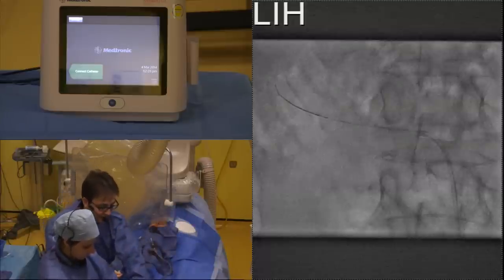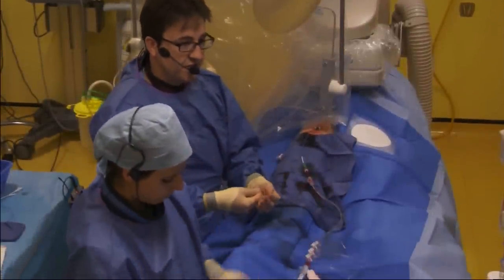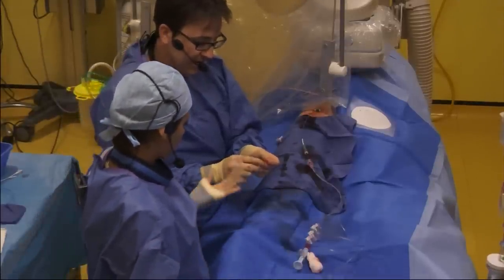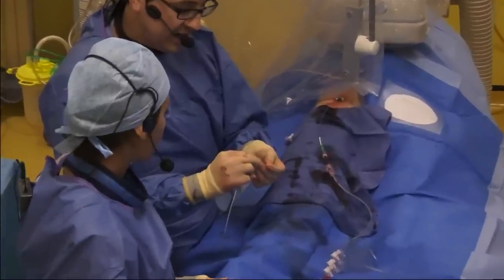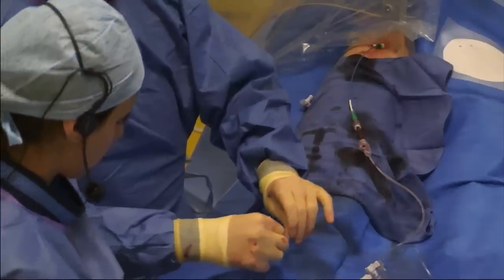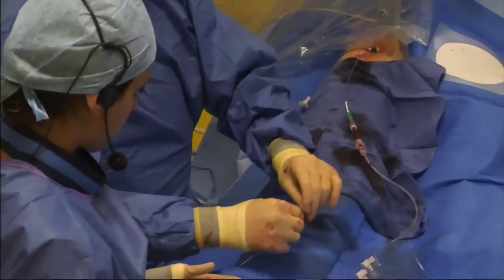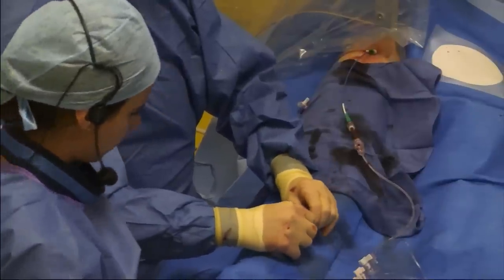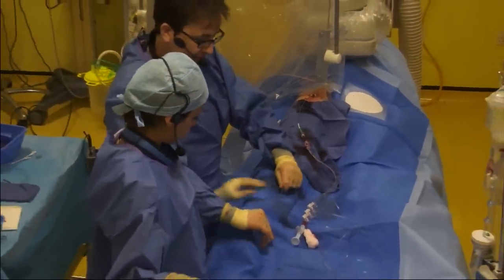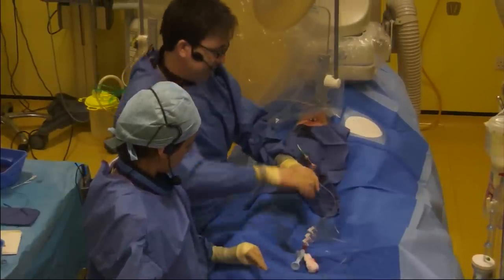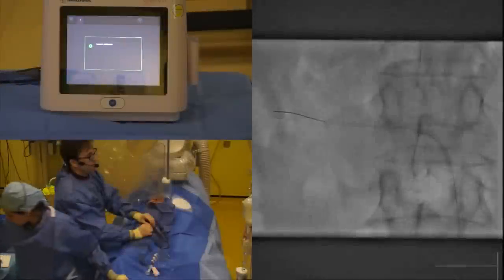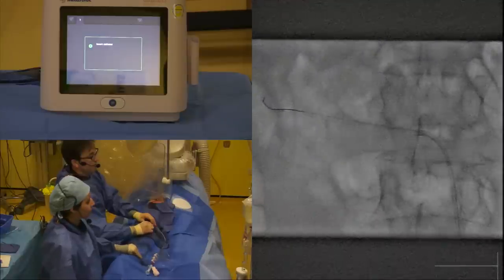We've got the spiral catheter out again. I'm just going to run through this and take you through how I would do this from a clinical perspective. Rush is connecting that up to the console itself. I'm attaching this to the guide rail. I've actually elected to go for a choice rail again, same as we ended up with in the last case, just really because I think, gaining experience here, this certainly made that last case much easier.